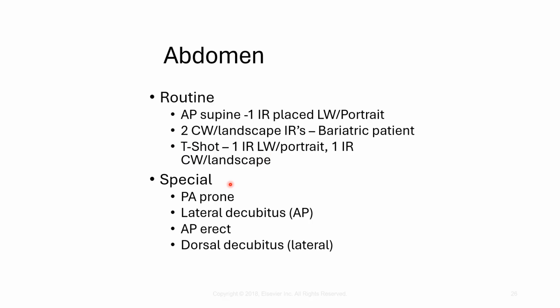Some of the special views would be a prone abdomen, a lateral decubitus abdomen, an erect abdomen, or a dorsal decube. So in this video, we're just going to talk about the routine supine abdomen. In another video later on in the week, we'll talk about these other images.